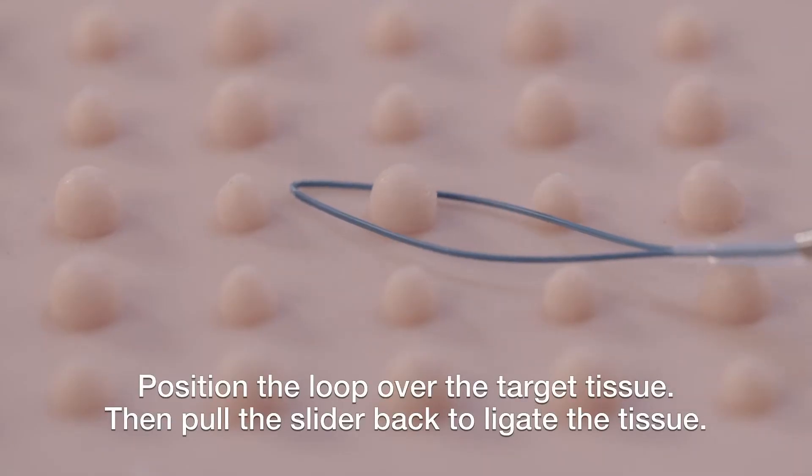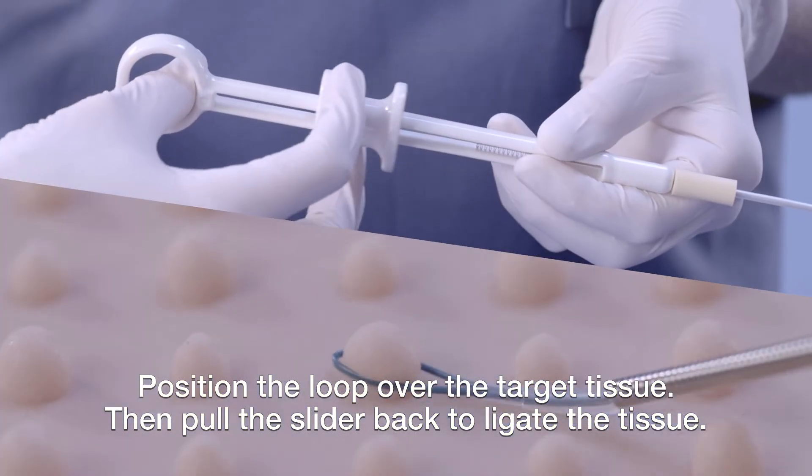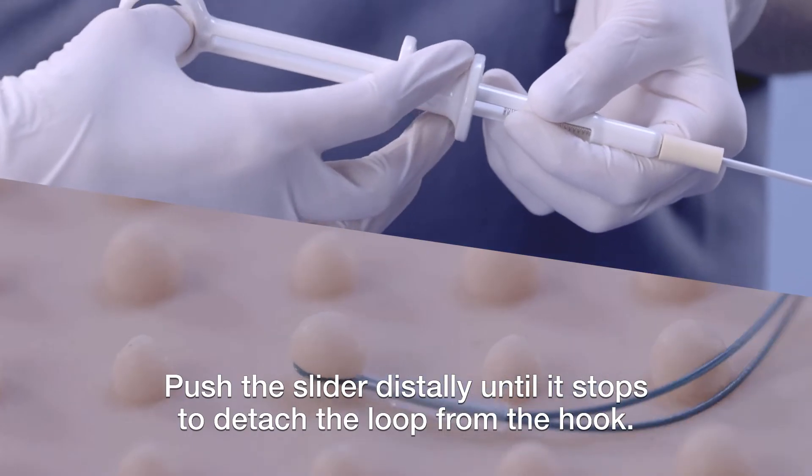Position the loop over the target tissue, then pull the slider back to ligate the tissue. Push the slider distally until it stops to detach the loop from the hook.